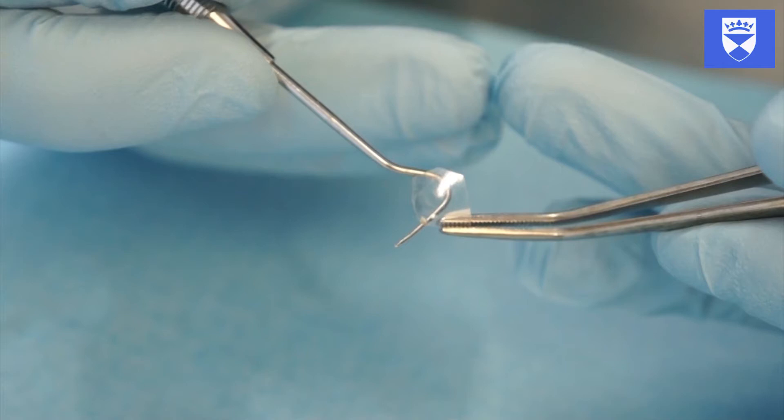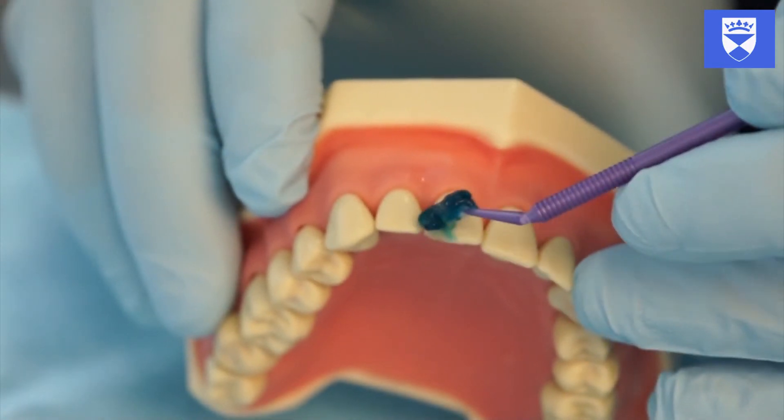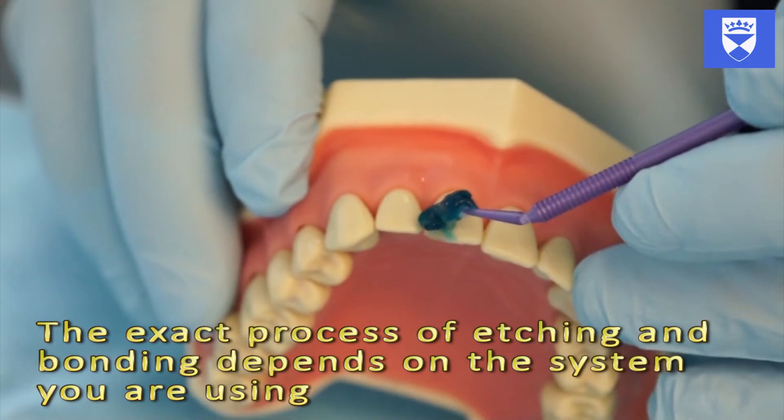For safety, hold the crown form firmly using a locking instrument such as locking tweezers when making adjustments. Etch the tooth structure to be bonded, taking care to only etch up to the edge of the bevel.